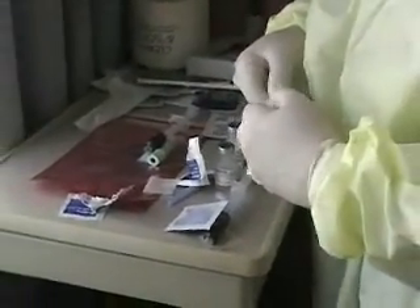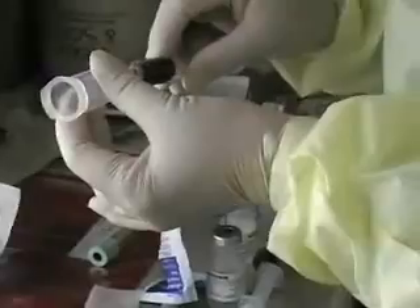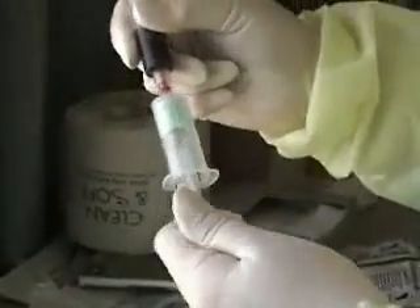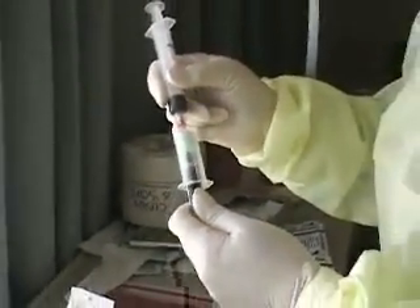That's our sample. We'll use the transfer to put it into the vial. I couldn't feel that you stuck me to draw blood. I didn't have to stick you — that's why we did this, so we didn't have to stick you. That's nice. This is the transfer to the vial. The lab should give you the transfer equipment as well.